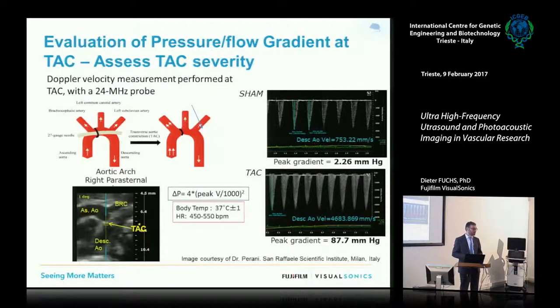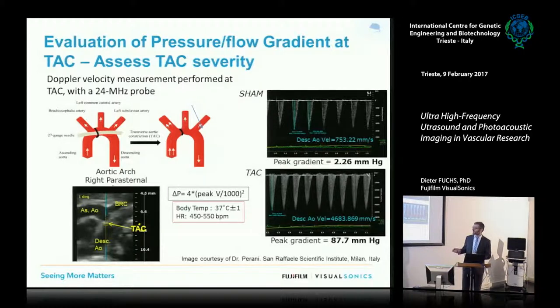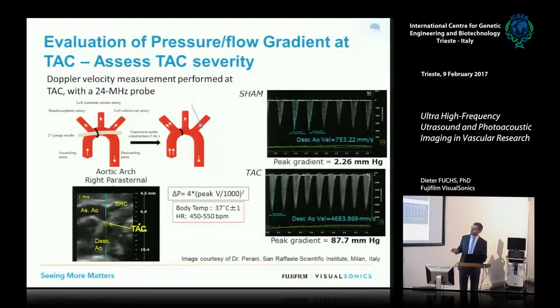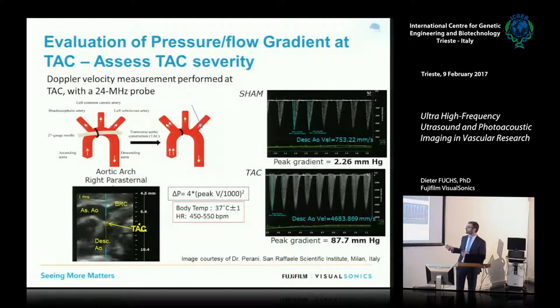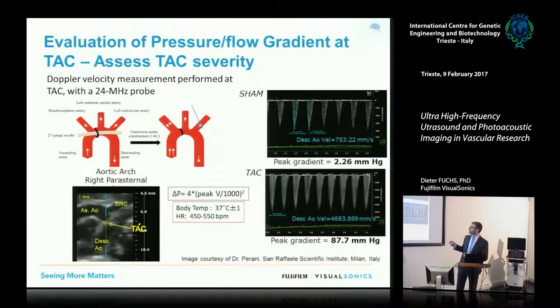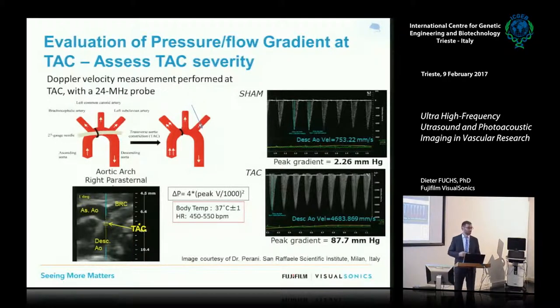We've had discussions about Doppler yesterday, so I added this slide — it's data from Dr. Perani in Milan. Randomization is done by assessing the flow through the stenosis, where in a healthy animal you have roughly 0.8 to 1.2 meters per second, and through the stenosis 3, 4, sometimes over 5 meters per second. You're able to assess this flow, look at turbulence versus laminar flow, and thereby randomize the animals.